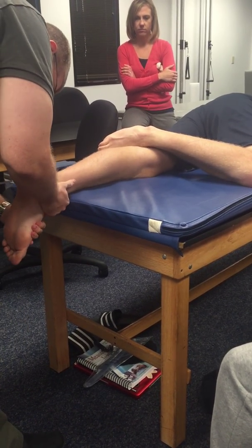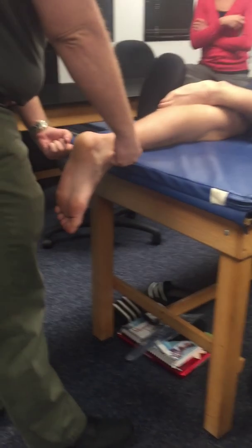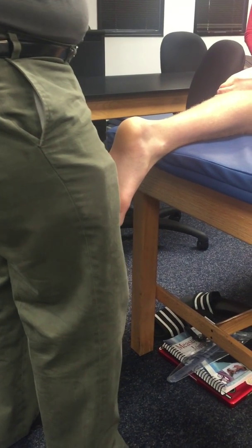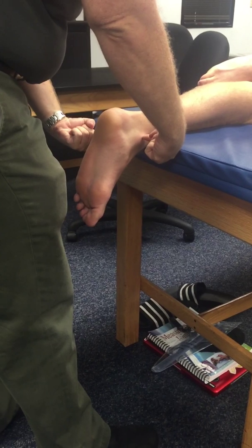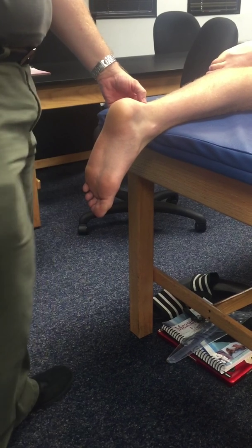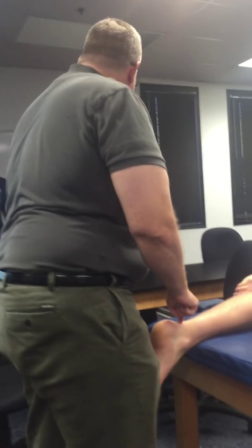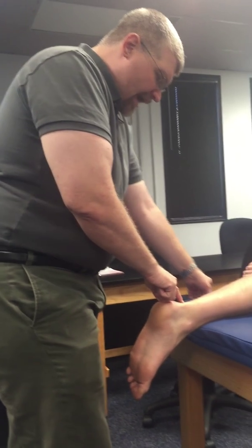The axis of movement: the two malleoli — imagine a line between the two. They're not parallel with each other; if you noticed from last time they're a little offset. So I have to look at that line and put my dot right in the center. This is a procedure where, if you're doing it on patients, you'll want to mark that with a little pen or marker so you know exactly where that spot is.